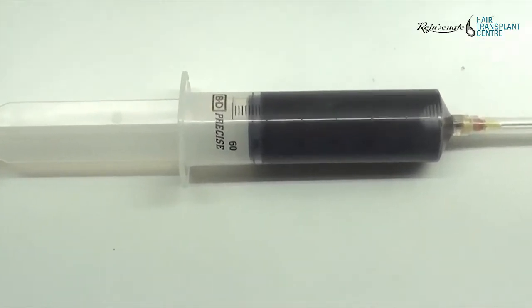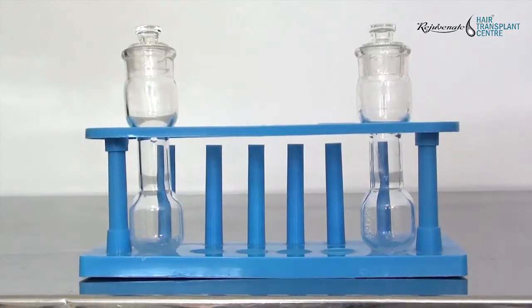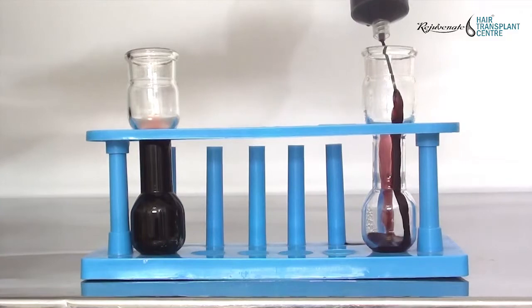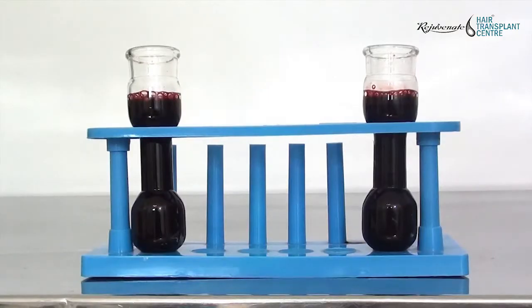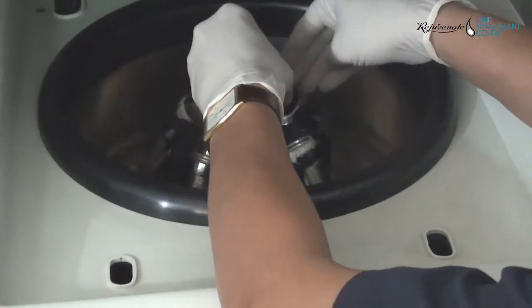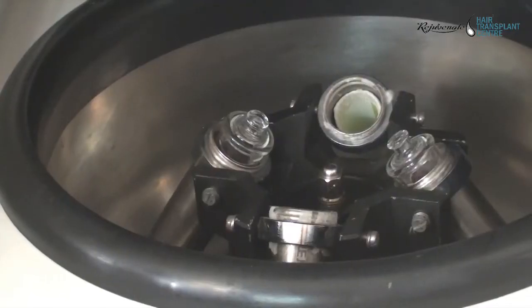The syringe now has a total of 50 ml. Two PRP kit containers are taken, and each container is filled with 25 ml of blood. Both containers are placed in a centrifuge machine for the first spin — 16 minutes at 3000 rpm.